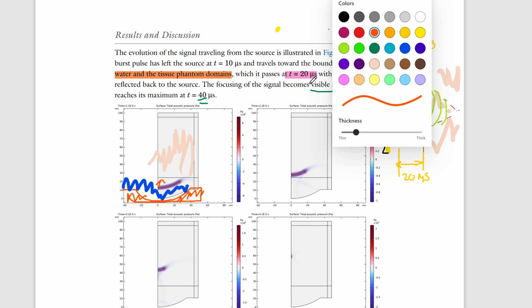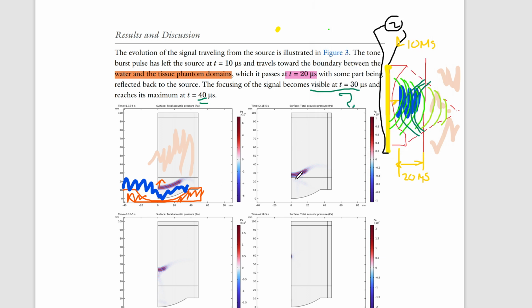And this might not be showing up on the screen, but we have a wave here and here. These are some reflections occurring, which they said. And some parts are reflected back to the source. We have these here. These are reflections. And we've crossed the boundary, okay? We're still moving upwards. And what we're looking for is that peak intensity, that peak pressure. So next we have time is equal to 30.